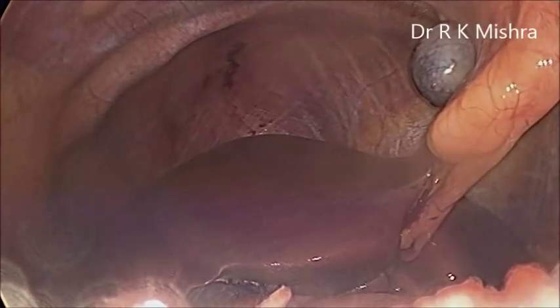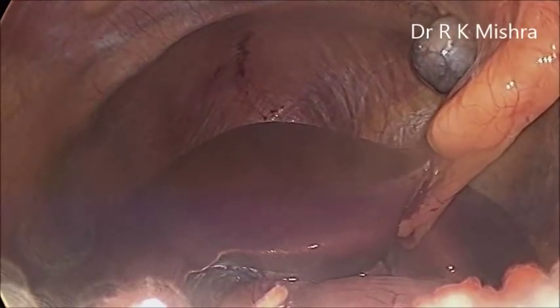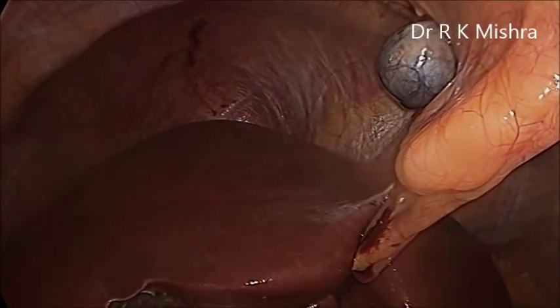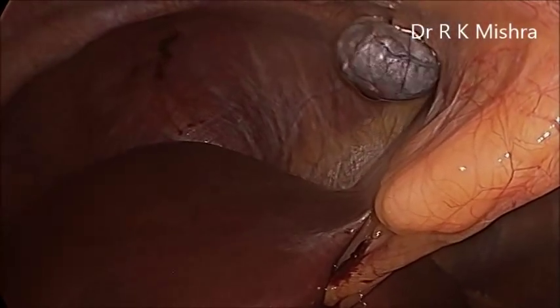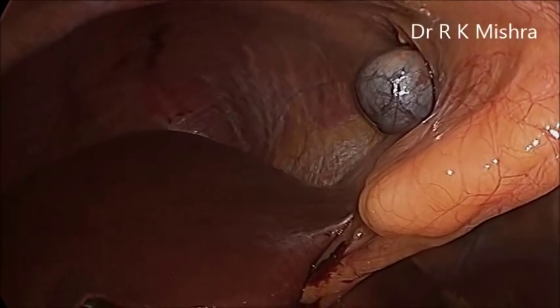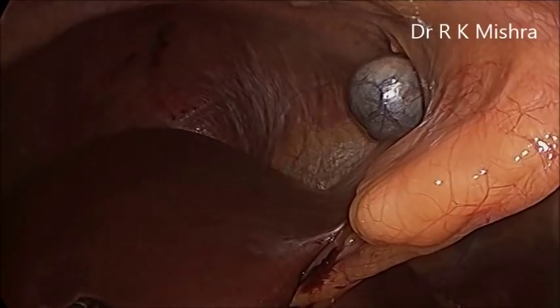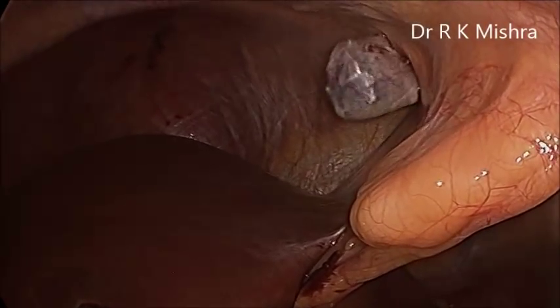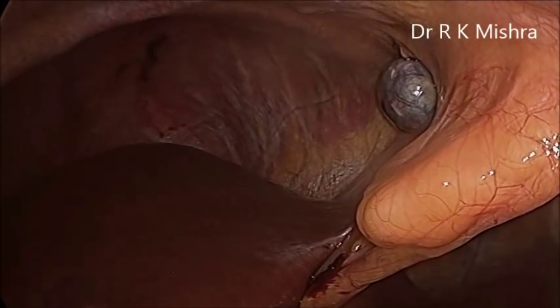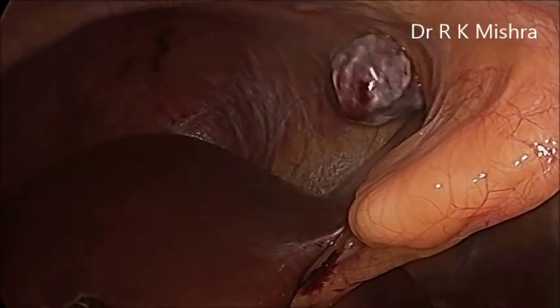You can use the endo bag also, that's a very good idea, but of course cost effectiveness is one of the factors why we have to be careful. Although Americans generally use the endo bag routinely, the purpose is that it will not contaminate the port wound and metastasis can be minimized, but the incidence of this type of gallbladder is very low. If it is not looking good, fibrotic and bad, then in our practice also we use the endo bags. Sometimes we make the endo bag from gloves.